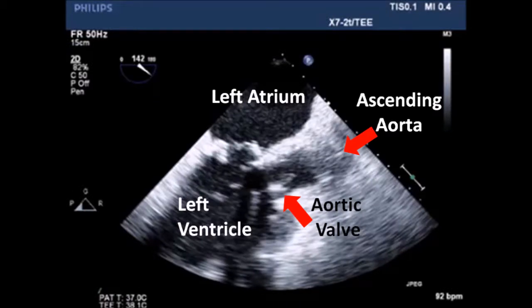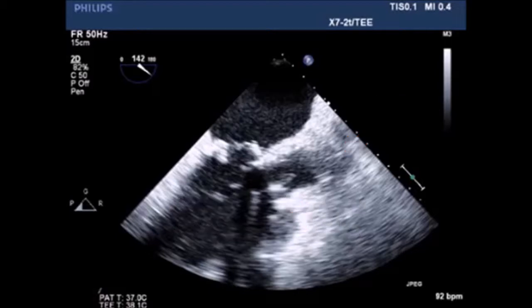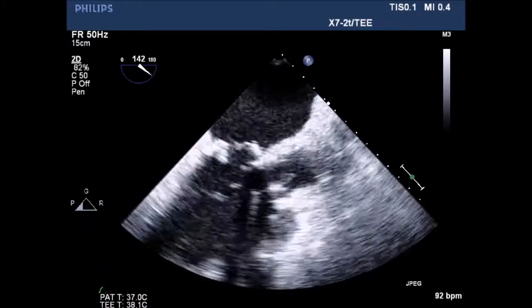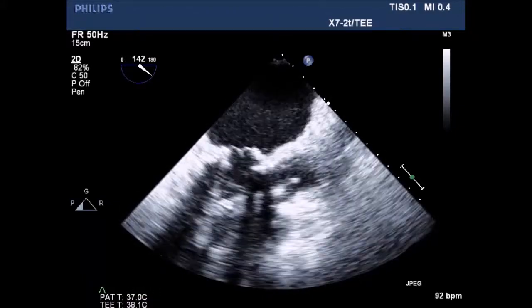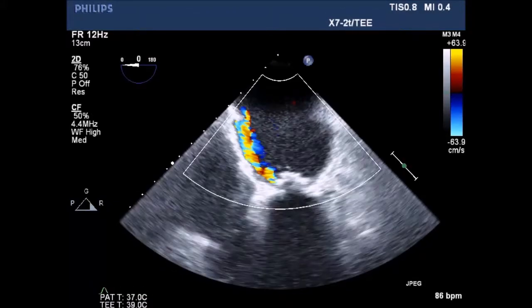A long axis view of the bioprosthetic aortic valve. There was some restriction on the right cusp, but no increased velocity and no significant gradient across the aortic valve.